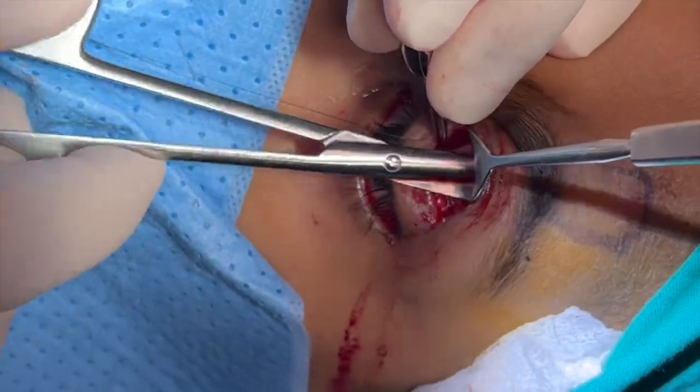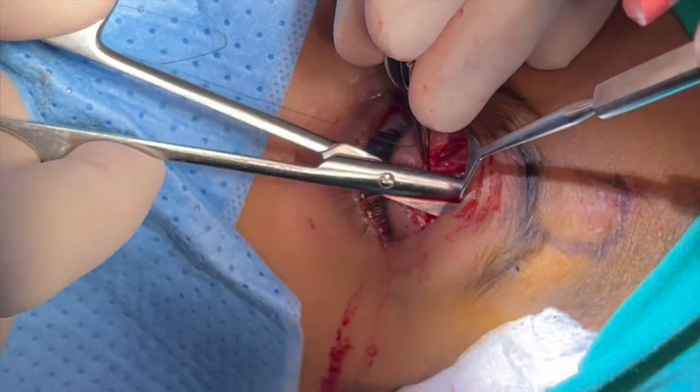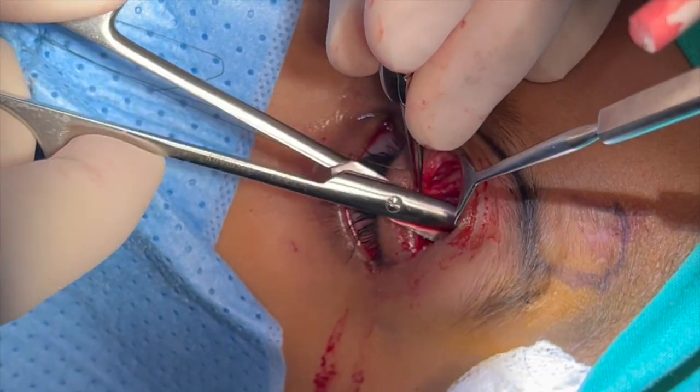We are continuing the dissection, making sure to go at least 2 cm above the superior orbital rim over the frontalis muscle flap.